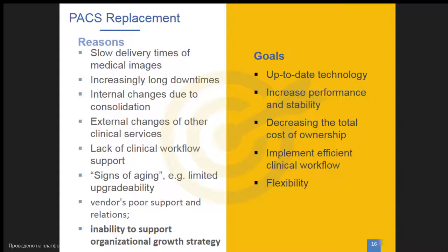Why do you need to replace the PACS? The reason might be slow delivery times of medical images, long downtimes. There might be internal changes because of consolidation of radiology when you join together or merge X-ray, CT, MR, ultrasound departments.